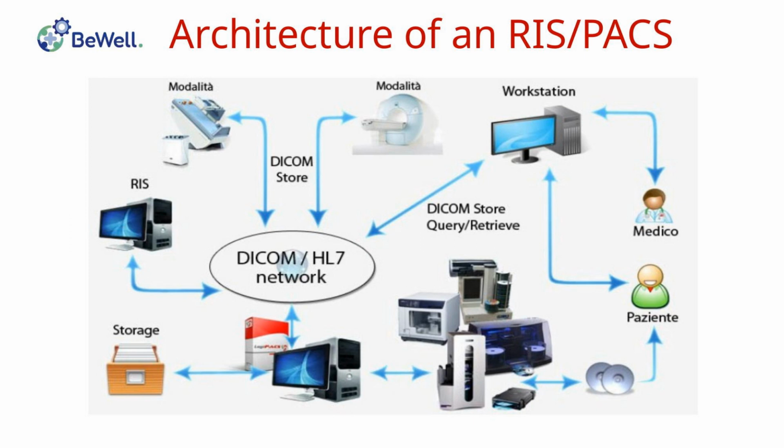In the figure, a diagram is shown summarizing the hardware, client, workstation, modalities, various applications such as film scanners, etc., used to support the aforementioned functions, highlighting the communication standards and connections between the various data transfers. We can note also that specific hardware requirements may vary based on the RIS-PACS vendor and the specific needs of the healthcare facility. Consulting with the system provider or the IT specialist would be beneficial to determine the exact hardware needs for a particular RIS-PACS implementation.